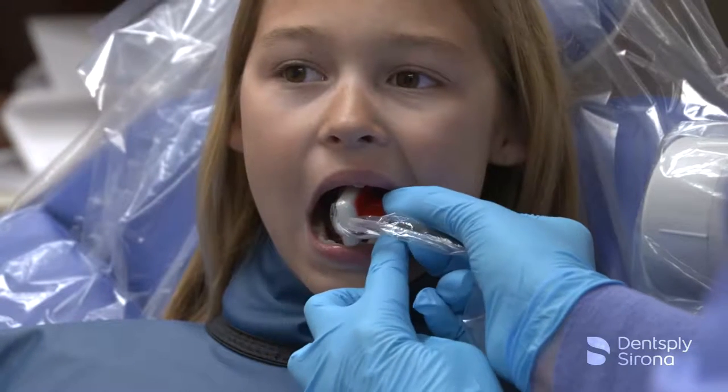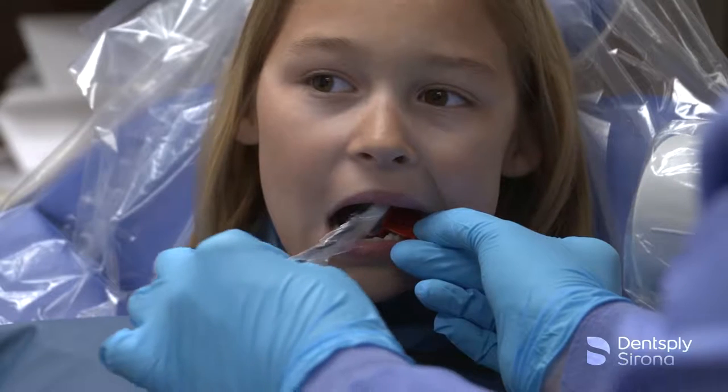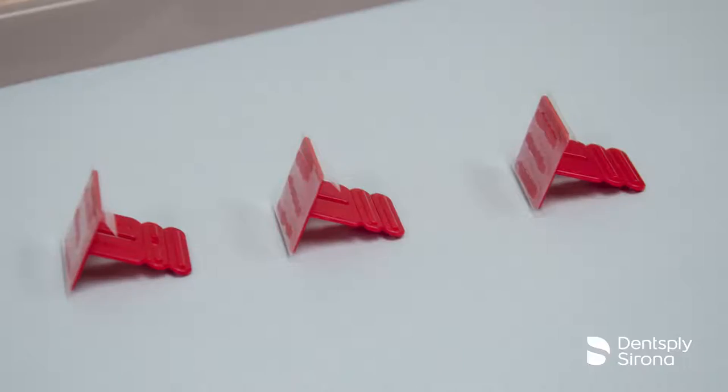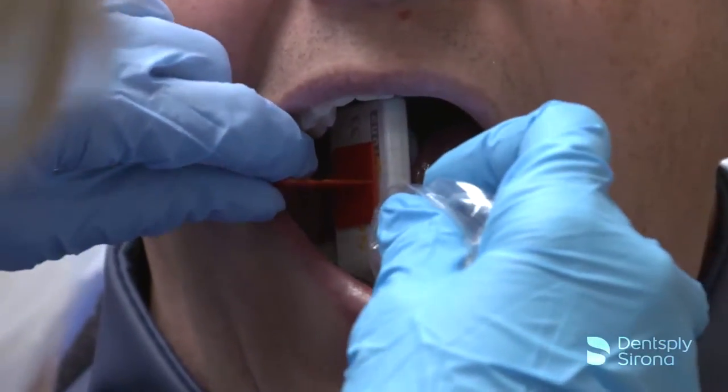Indicated for horizontal and vertical bitewing radiographs when using digital sensors, the FastTab bitewing holder is a disposable adhesive bitewing tab for use with RIN tight sensor covers.